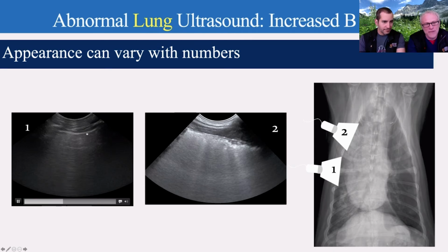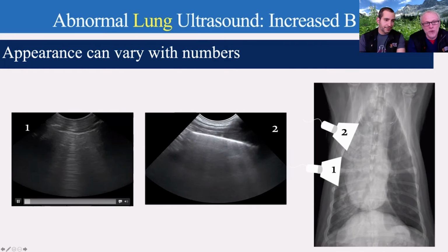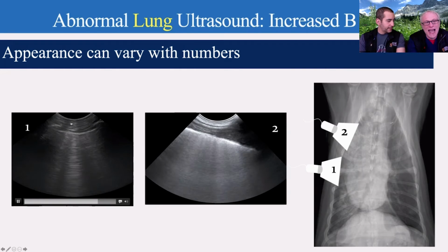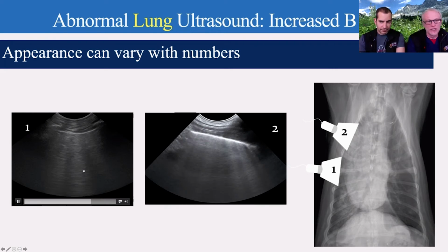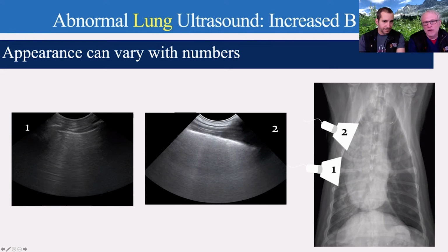And I look here. Do you see vertical white lines? I sure do. Do you have a pneumothorax, yes or no? You do not have a pneumothorax. And do you have an increased number of B lines? Yeah, I probably see 5 or 6 there, Dr. Boysen. All right, so this by definition is pathologic. We've got alveolar interstitial syndrome at this window. It's probably equivalent to, on a radiograph, say the site number 1 labeled here with the ultrasound. Yep. So there's alveolar interstitial.